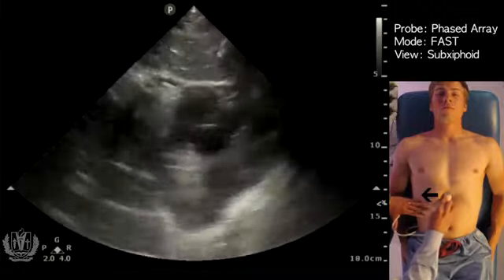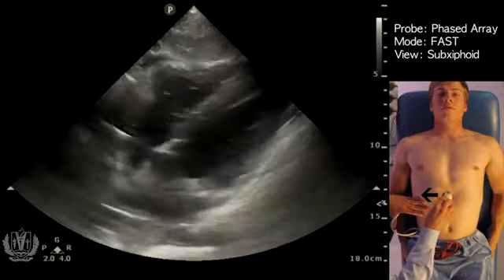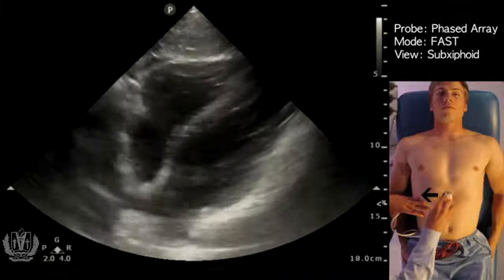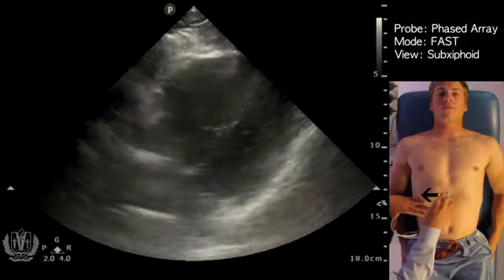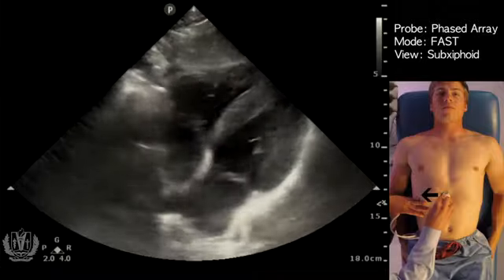And when the patient takes a big breath in, it brings the heart closer, and you get a better subxiphoid view, looking for pericardial effusion around the right ventricle or left ventricle, and looking for any collapse of these ventricles, signifying tamponade, specifically right ventricular diastolic collapse or right atrial systolic collapse.